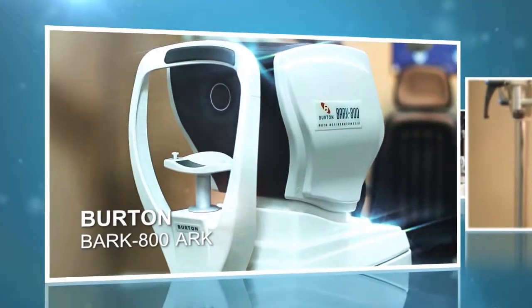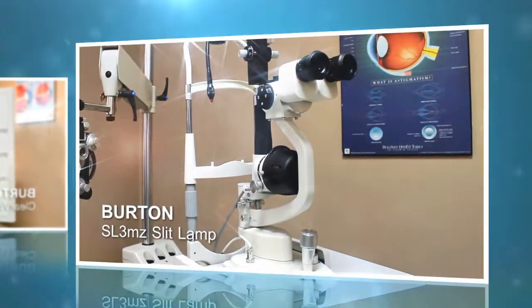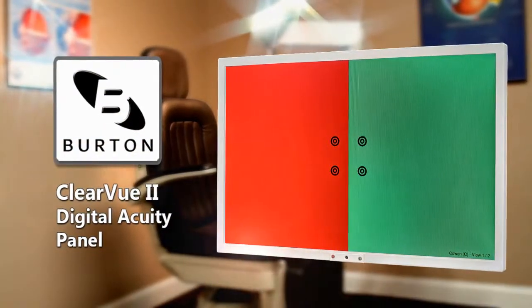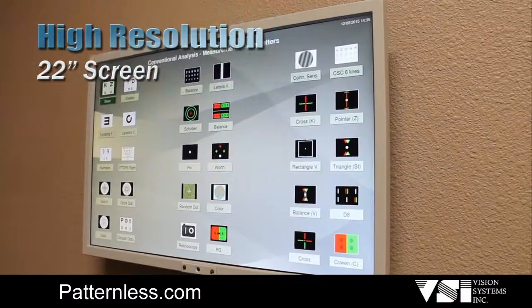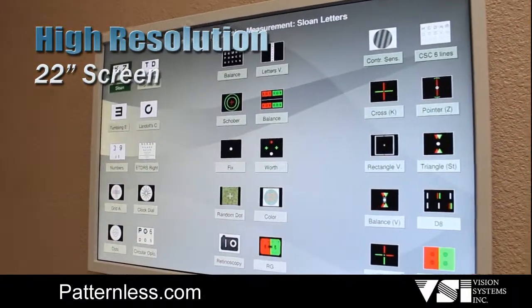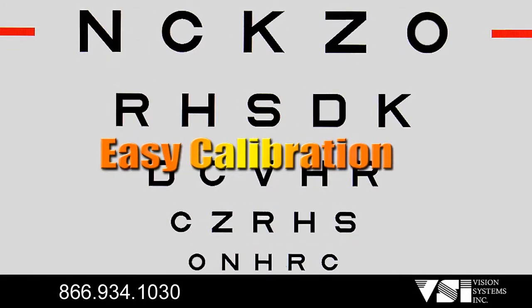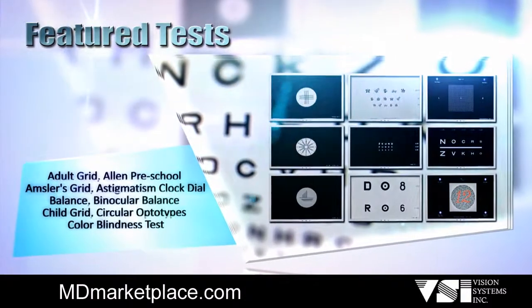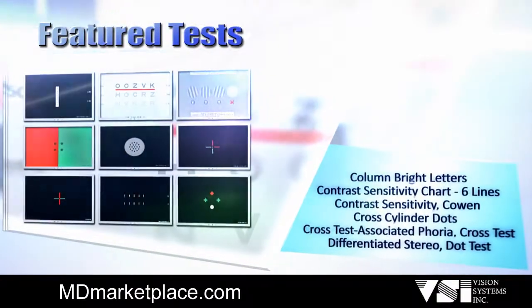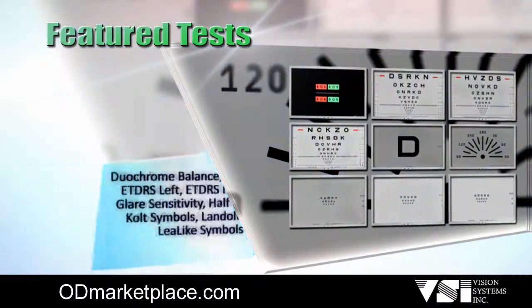VSI is proud to introduce the new generation of Burton ophthalmic equipment, presenting the all-new Burton Clearview 2 digital acuity chart featuring a high-resolution 22-inch screen. Simple installation, easy calibration, designed for virtually any size room, the Clearview 2 offers a wide variety of tests allowing eye care professionals the ability to perform the most comprehensive eye examination available in the industry today.